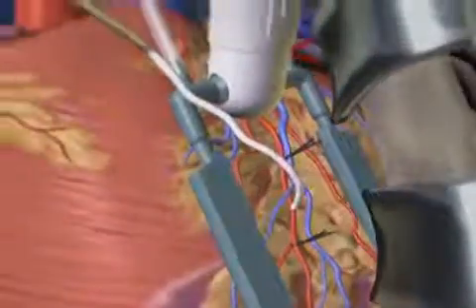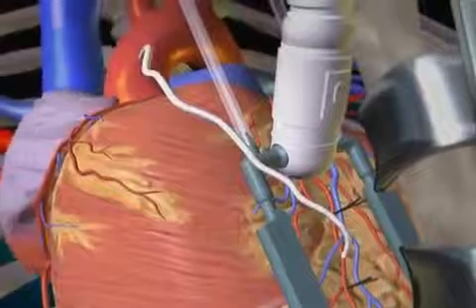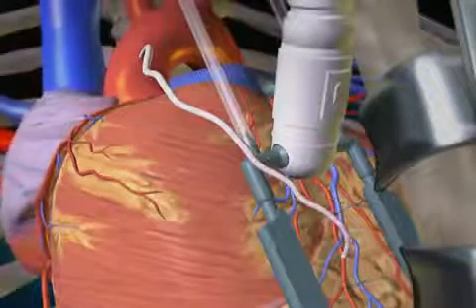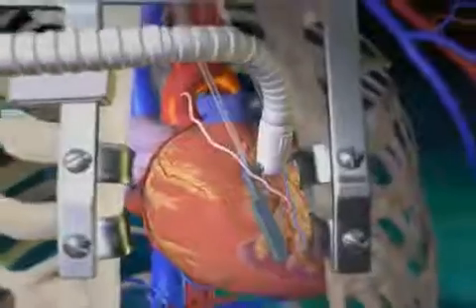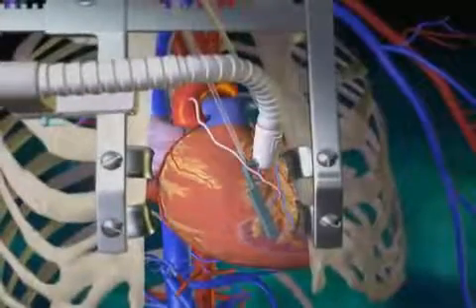A vessel taken from another part of the body is attached from the aorta to a point beyond the blockage. The clamps are loosened and blood flow resumes through the repaired artery.